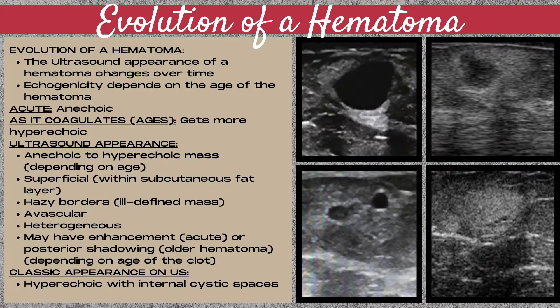The evolution of a hematoma: a hematoma is a mass that will change appearance over time, and the echogenicity of the hematoma depends on the age of the hematoma. When a hematoma is acute, meaning it just occurred, it's going to be anechoic and look like a cyst. As this pocket of blood coagulates or ages over time, it's going to become more hyperechoic in appearance.